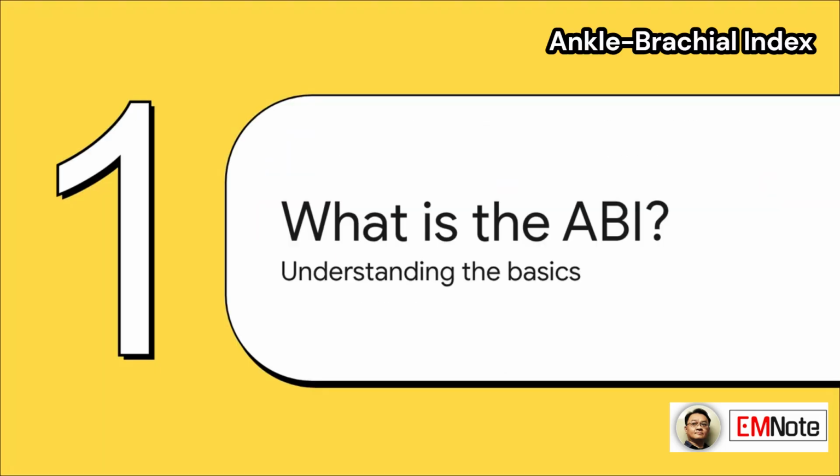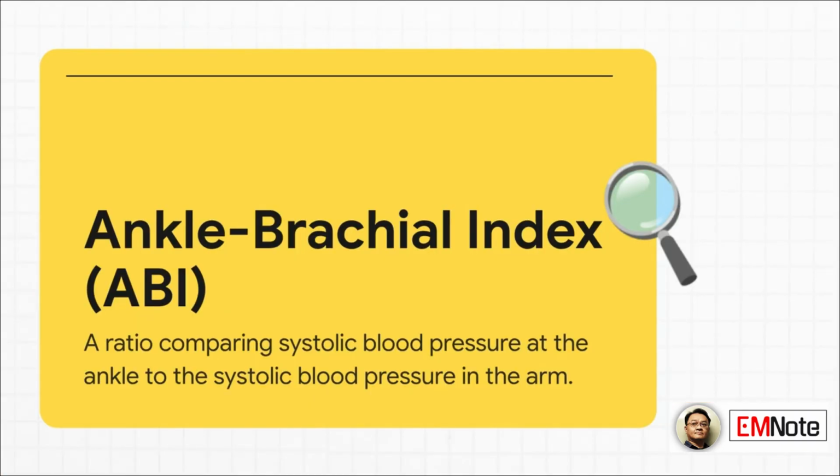So first up, the fundamentals. What exactly is the Ankle-Brachial Index, or ABI? Put simply, the ABI is a ratio. It's a straightforward, non-invasive comparison of the systolic blood pressure at the ankle to the systolic pressure in the arm. This ratio gives us a clear picture of blood flow to the lower extremities.